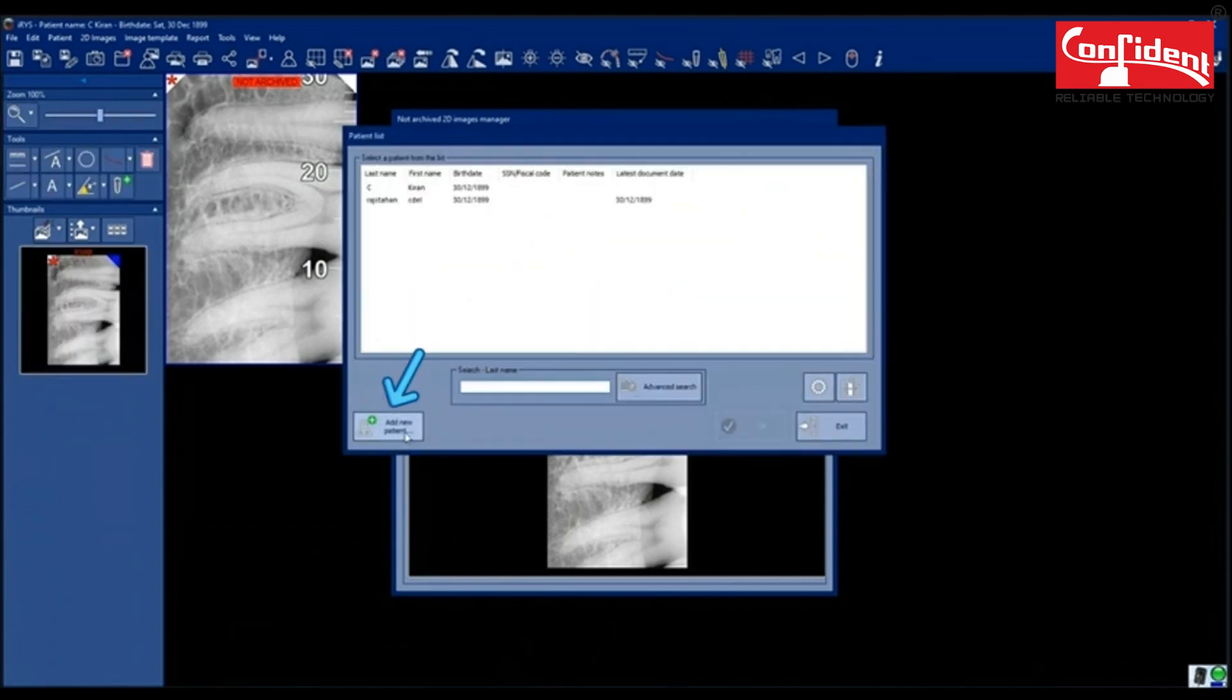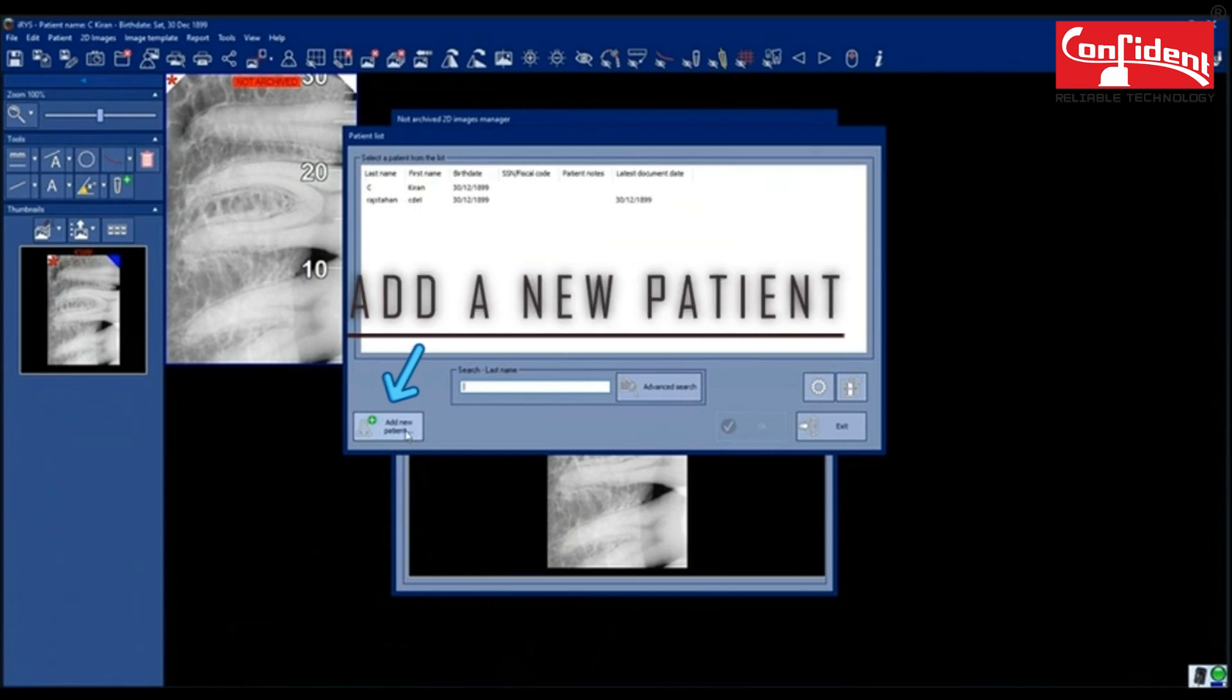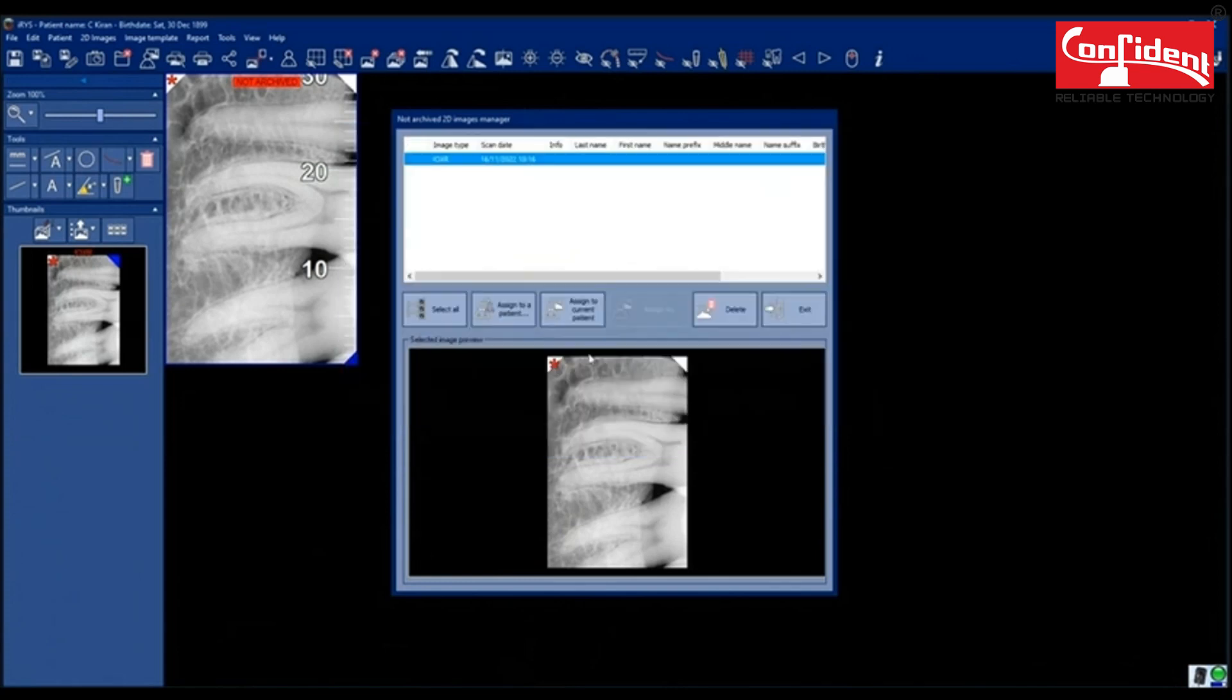In order to add this to a new patient click here, in this case, I will add the image to the current patient.